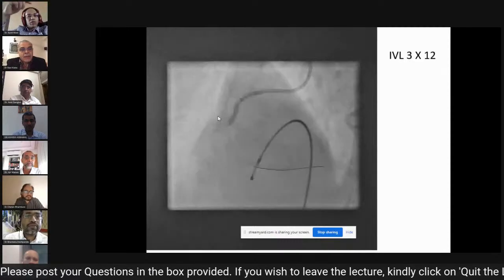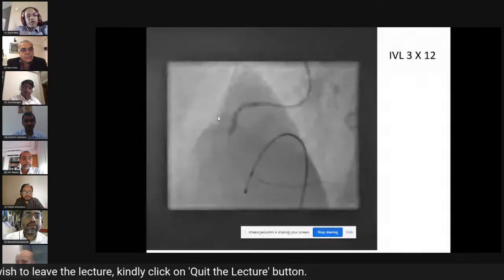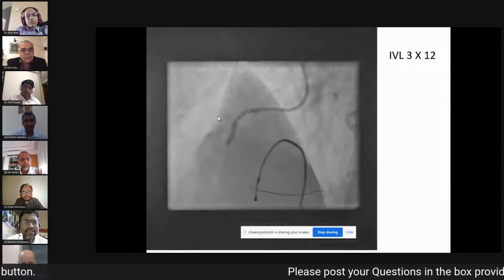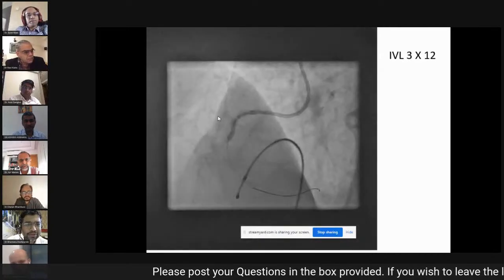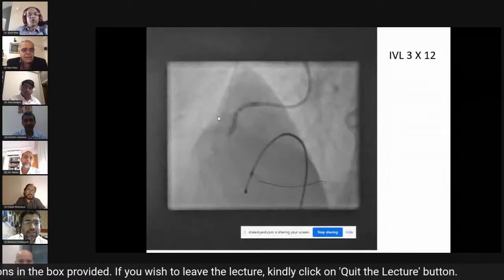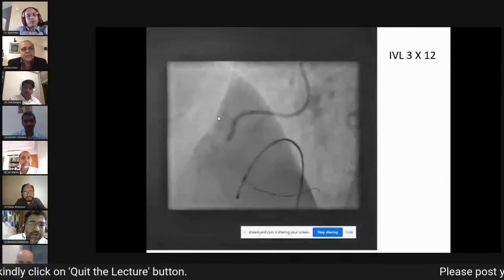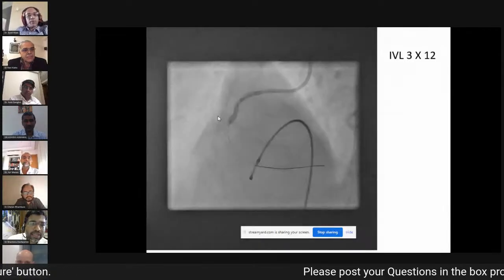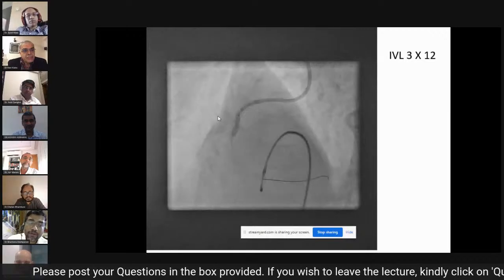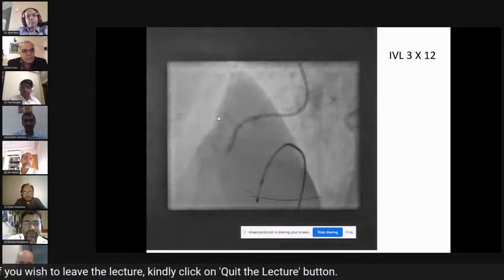And when you have the rota, do you think you, with more experience on rota, have any experience where the burr gets stuck? No, I think it's a discrete lesion. In this situation, I wouldn't expect the burr to get stuck, because if you go slow, the burr should not get stuck. Secondly, your balloons were getting obstructed, even your OCT catheter was getting obstructed in the proximal segment where the previous stent was, not at the lesion site. That might be because of wire bias and guide alignment. Sometimes things are obstructed because of that. Yeah, you can go ahead now.